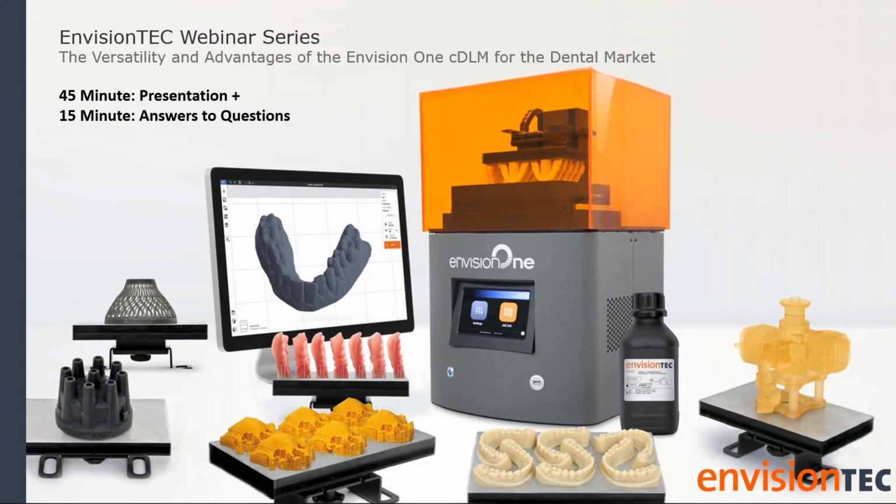So the smoother the surface you have, the finer the finish, the more it's going to replicate the intended digital design. If we print at 50 microns, that means our layers are half the thickness than at 100, giving us a little bit more accuracy because that resolution, that surface finish, is going to reflect more of what was intended with the digital file.